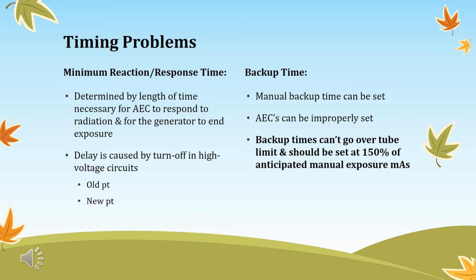Reaction and response time is determined by the length of time necessary for the AEC to respond to radiation and for the generator to end the exposure. Delay is caused by turn-off delay in high-voltage circuits.